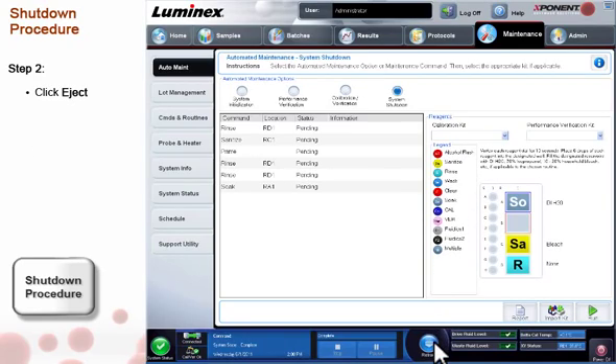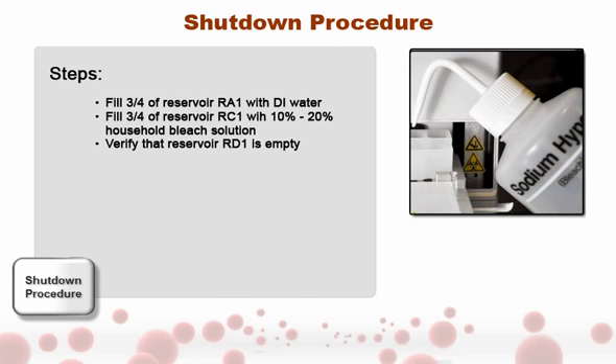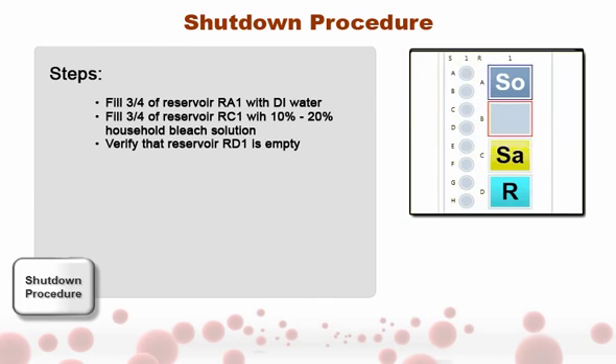Click Eject. Fill Reservoir RA1 with deionized water. Fill Reservoir RC1 with 10% to 20% household bleach solution. Verify that Reservoir RD1 is empty.